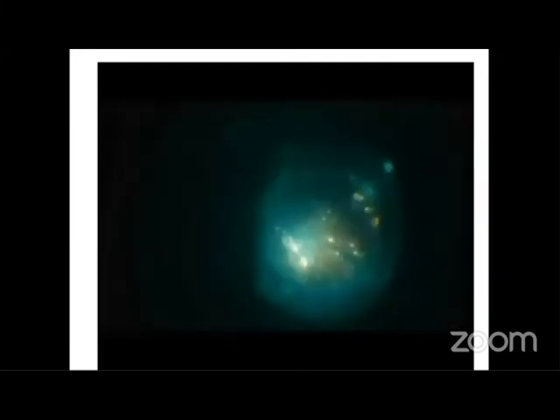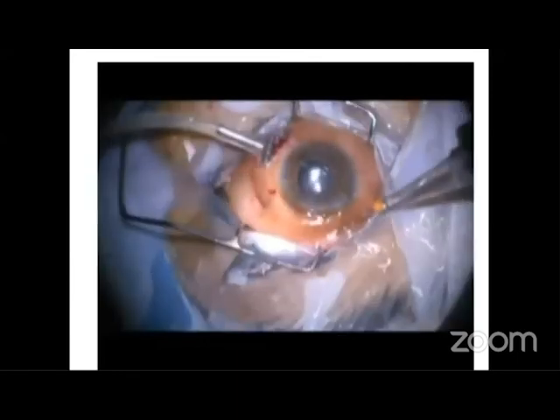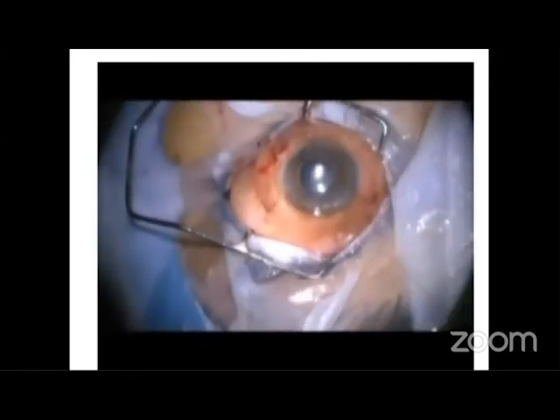Visualization is a challenge. Vitrectomy is completed, and healthy retina is identified and delineated from the necrotic retina and the areas of scarring. Once that is identified, the healthy, viable retina is separated from and isolated from the scars and the diseased necrotic retina so that the viable retina can reattach. Endolaser is done around the edges of the retinotomy. Silicone oil is injected, and we end the surgery with intravitreal antibiotics.